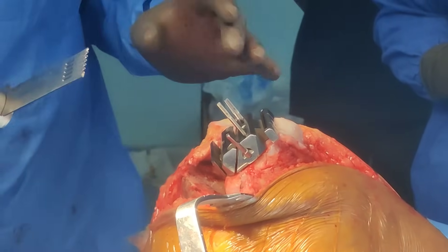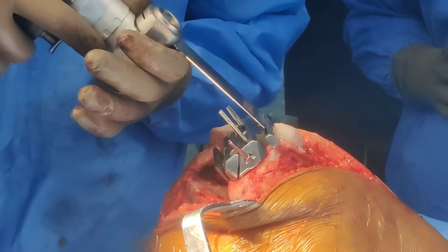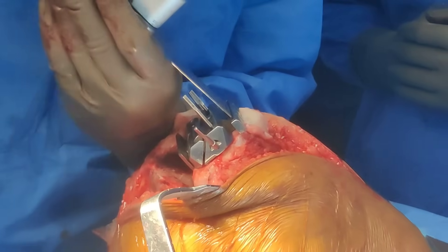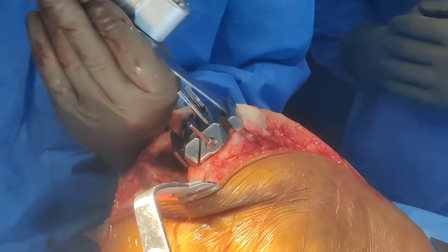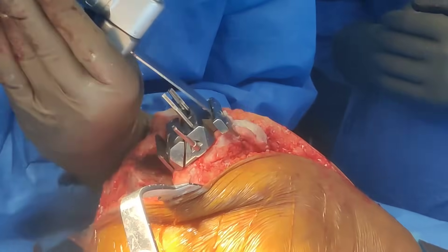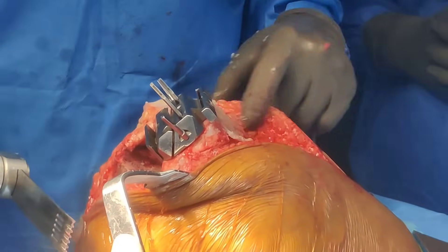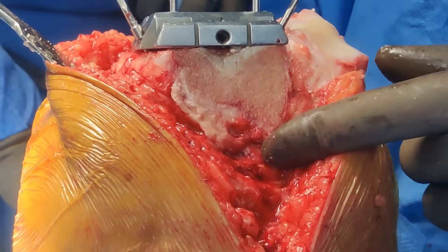We have done two cuts and are moving on to the third cut. We have decided on sizing, and again the same principle — you can cut forward but there's a good chance you will take more bone, so again upside down, resting on the patient at full speed. If you are starting up, bend down to make sure the blade is straight. Once done, you can see this beautiful cut — like a grand piano — a perfect perfect cut.